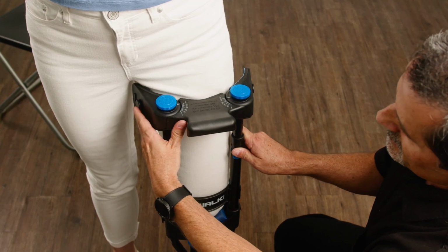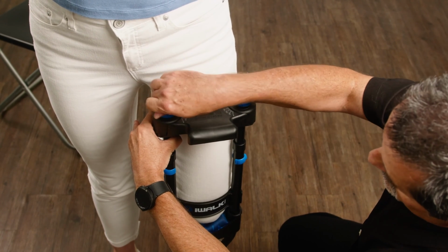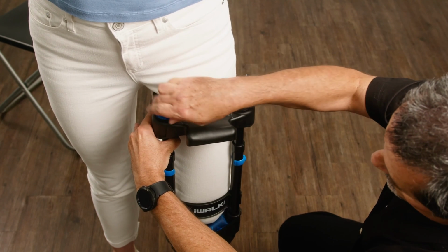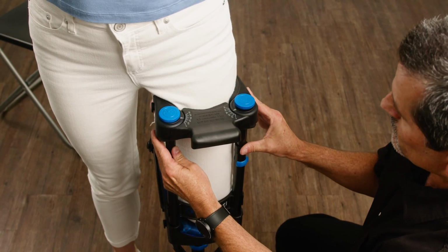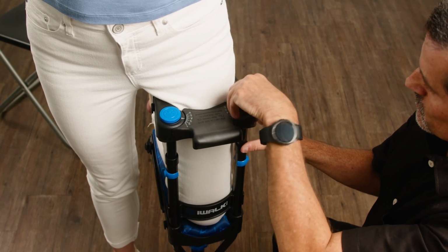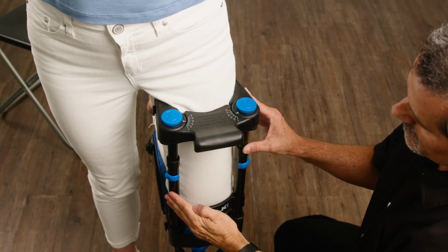With the patient's weight still distributed 50-50, grasp the tube and rotate the inner thigh support until it is in firm contact with the patient's inner thigh. Then lock in this setting by fully tightening the thumb screw. Check to see that the patient is still distributing their weight 50-50. Then rotate the outer thigh support until it comes into firm contact with the outer thigh. Then fully tighten the thumb screw. There should be no gaps between the patient's leg and the thigh supports or the back of the handle.